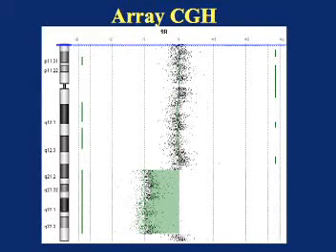By now you should be able to appreciate that the individual whose DNA is pictured here appears to have an interstitial deletion of chromosome 18. However, the microarray technique really only tells us about copy number changes. We really only know that this person is missing one copy of a section of chromosome 18 from the middle of the long arm. We do not know from this data where that piece of the chromosome from the bottom of the long arm that is in two copies actually resides.